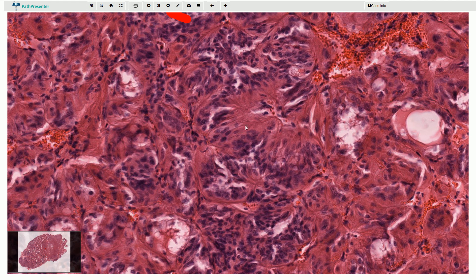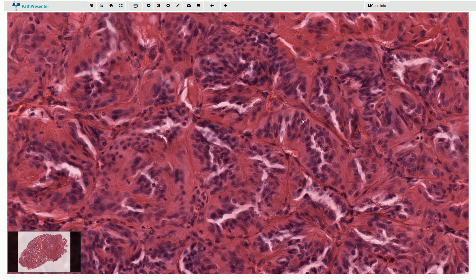The cells are elongated and they have finely granular eosinophilic cytoplasm. Some of the nuclei may have longitudinal grooves. Sometimes we can also see nuclear pseudo-inclusions.